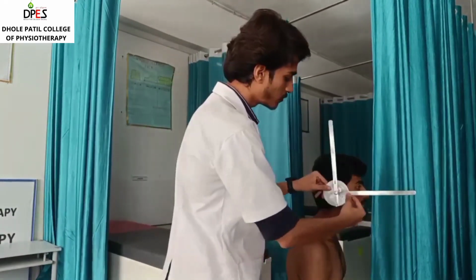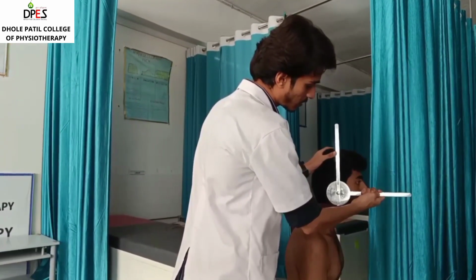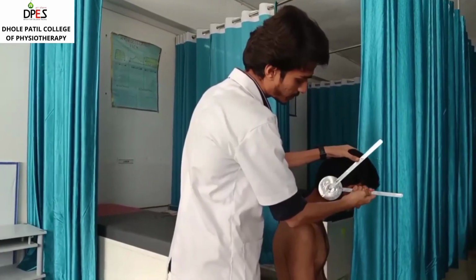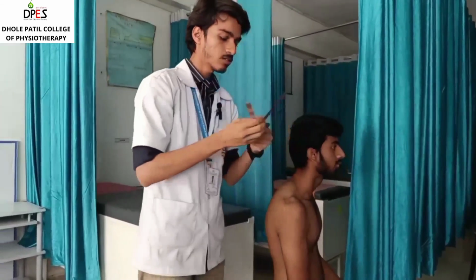So for performing the movement, I will first stabilize the goniometer and the proximal arm. Now I will perform flexion movement. Okay. So now the range is 65 degrees. Normal range is 60 to 90 degrees of the flexion.